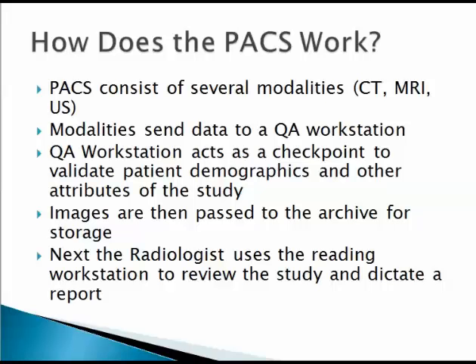Once this is done, the radiologist uses a reading workstation, a very high-end screen, to view the study, and then they use other software to dictate a report. So within a radiology department, you have images and you have reports.